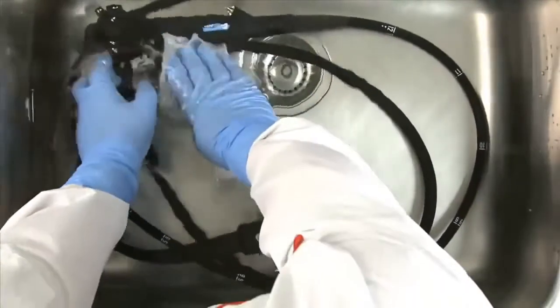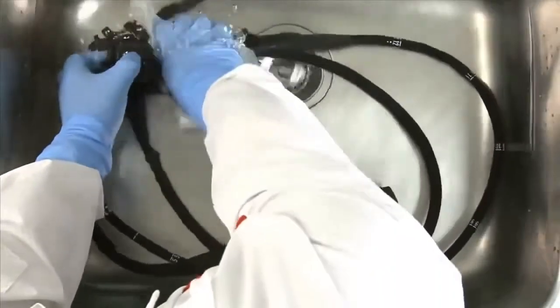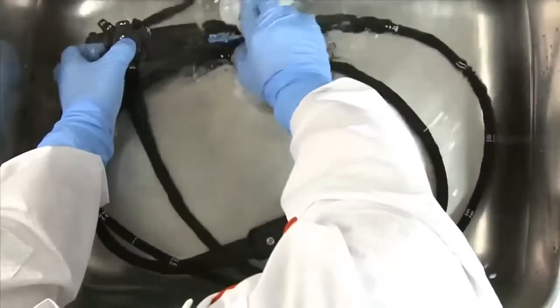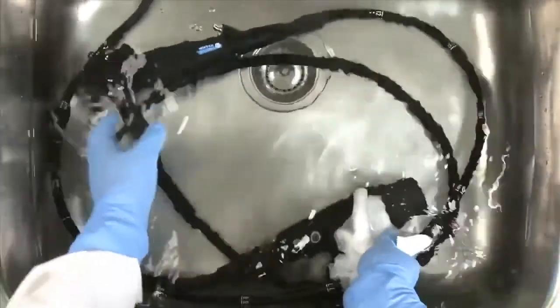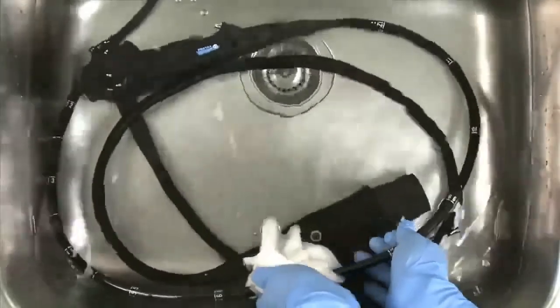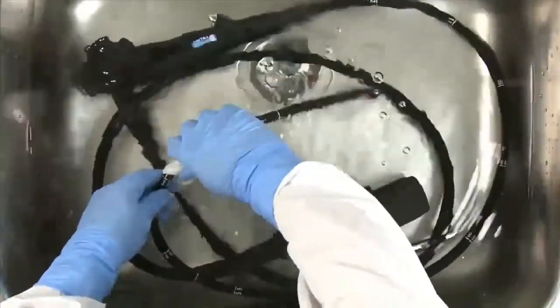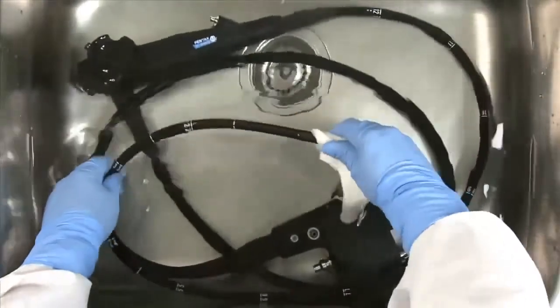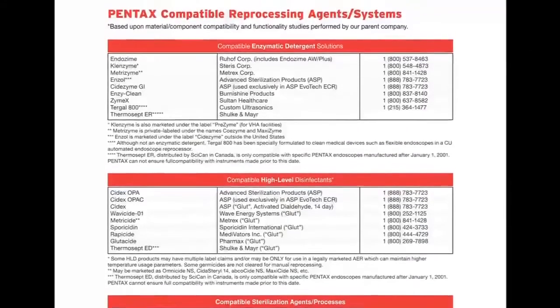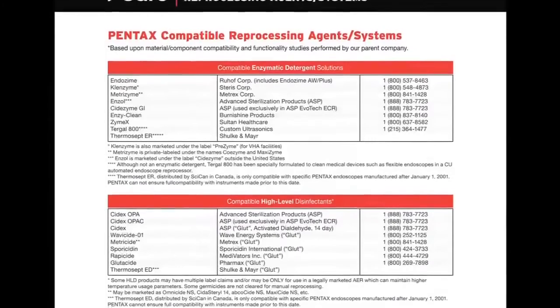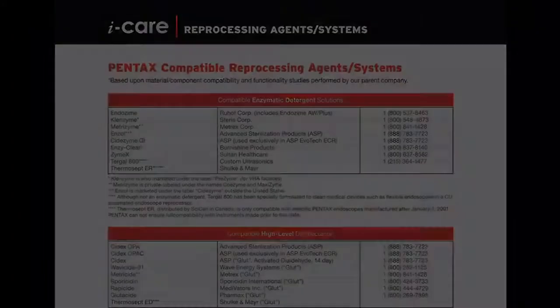While soaking, wipe the endoscope with a lint-free cloth from the control body to the distal end and down the umbilical to the PVE connector. Do not pull the flexible insertion tube or umbilical through your hands. To know which appropriate enzymatic solution to use, always refer to the Pentax-compatible reprocessing systems agent document.